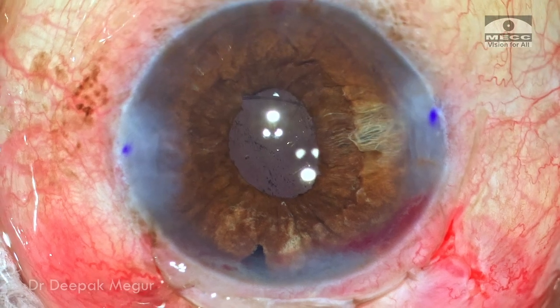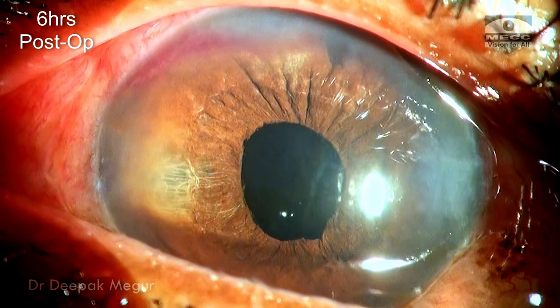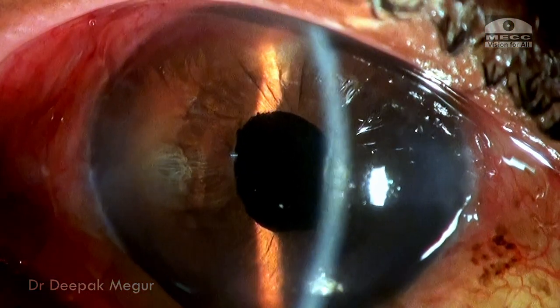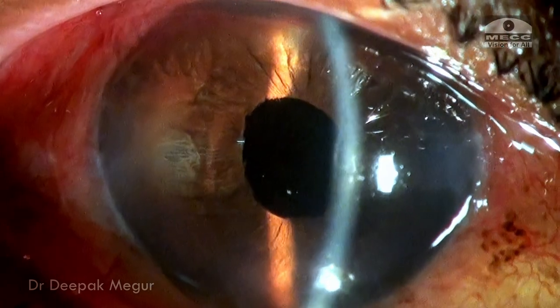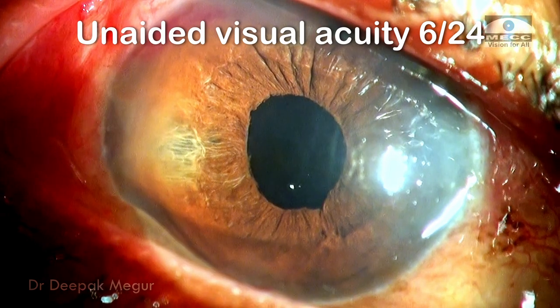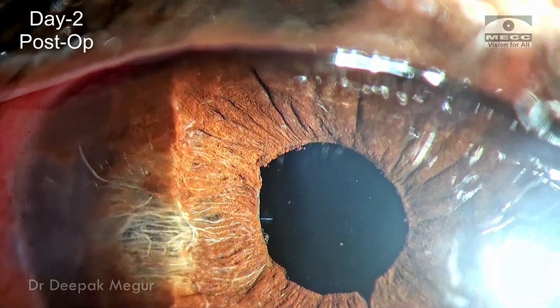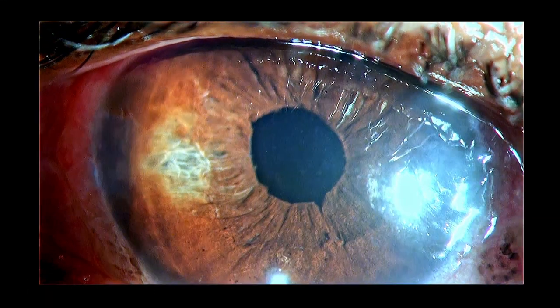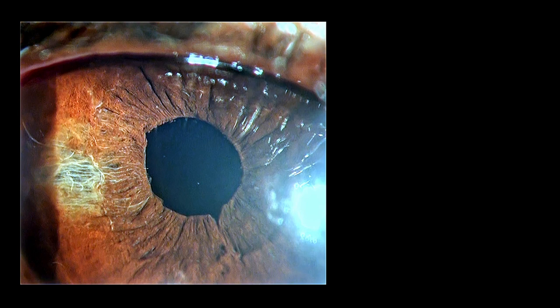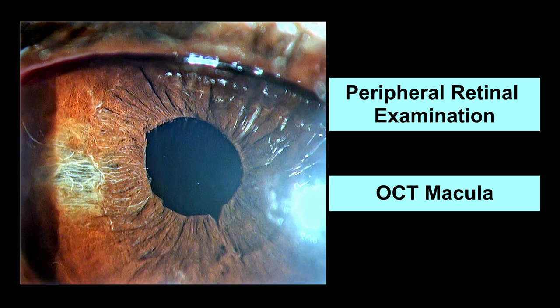The case is done. These are pictures taken six hours after surgery — the cornea is clear, the chamber is well formed, there is no vitreous in the anterior chamber, and the lens looks stable. The patient had unaided visual acuity of 6/24 on the next post-op day. In subsequent weeks, she is monitored with dilated fundus examination to look for any peripheral retinal breaks and the macula, and she undergoes OCT macula to look for cystoid macular edema.